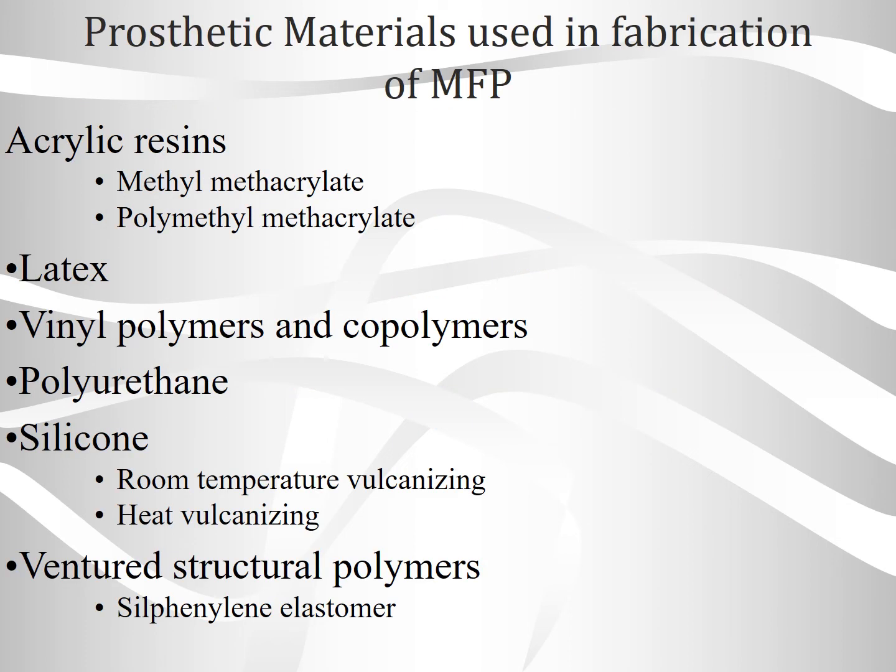Prosthetic materials used in fabrication of the MFP are acrylic resins, that is methyl methacrylate, polymethyl methacrylate. Then comes the latex. Then comes the vinyl polymers or copolymers.